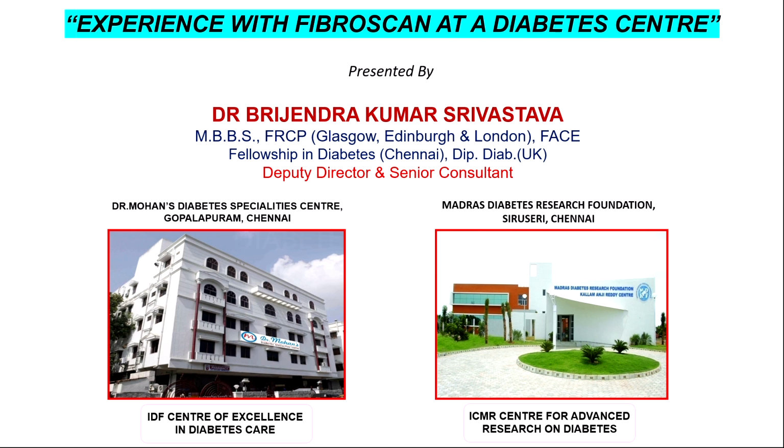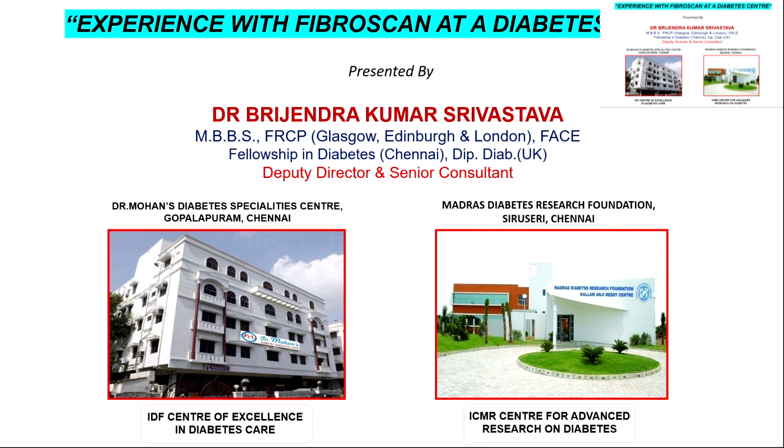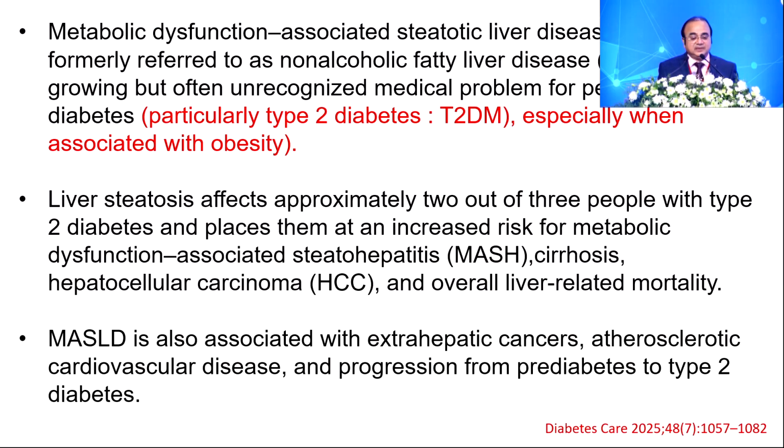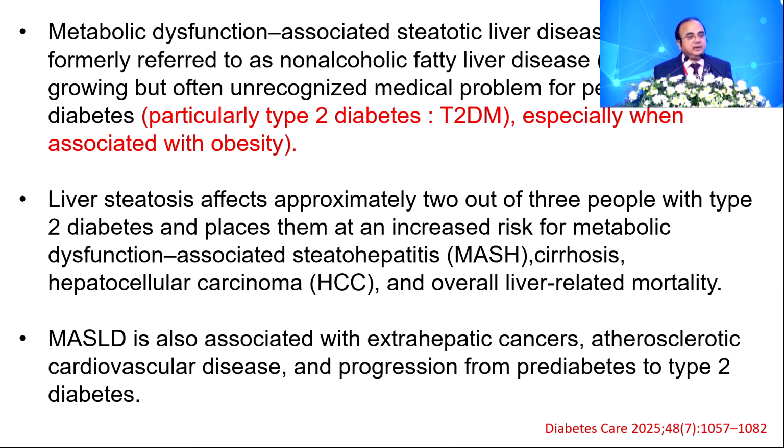Anyway, in the next few minutes, I will be talking about our DMDSC experience with the FibroScan. I'm Dr. Brijendra Srivastava here. And this is the ADA consensus statement recently published in Diabetes Care. They have very clearly mentioned that what was previously known as NAFLD is now called metabolic dysfunction associated steatotic liver disease.